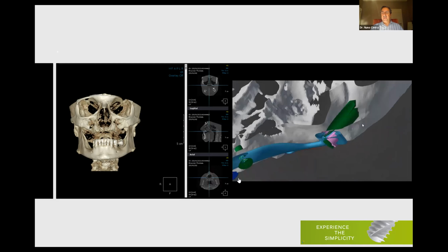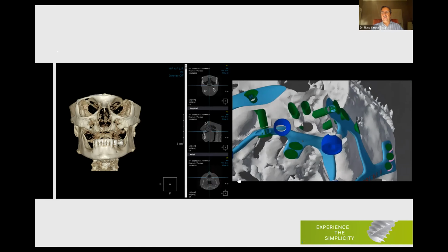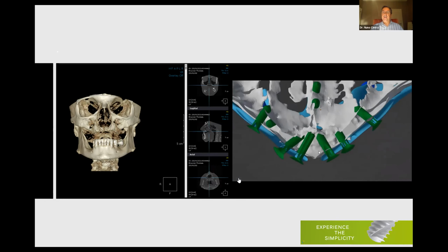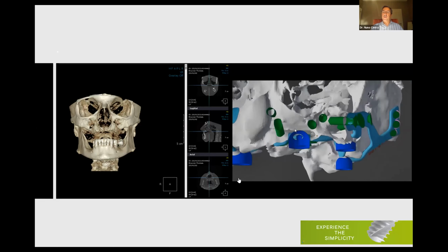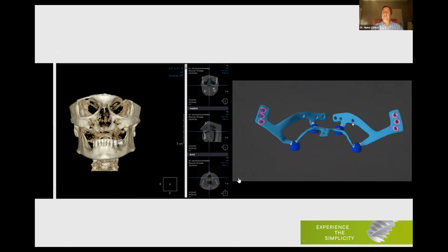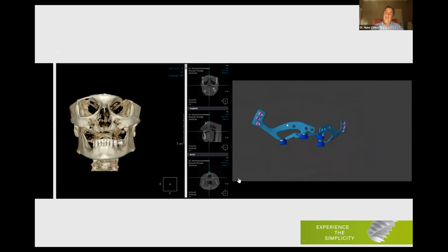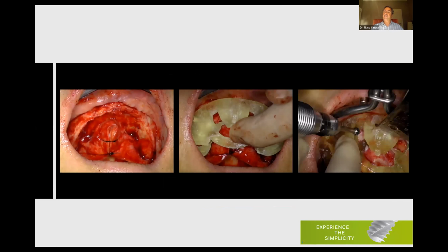With this 3D software, they have the ability to see where the patient has the most bone in order to place the screws. So they decided the best place to screw the implant to the remaining bone, and with screws ranging from 9 to 11 millimeters in length, we are able to fix this custom implant to the remaining bone. And the implant can be designed as you wish. It can be a 1-piece implant or a 2-piece implant.